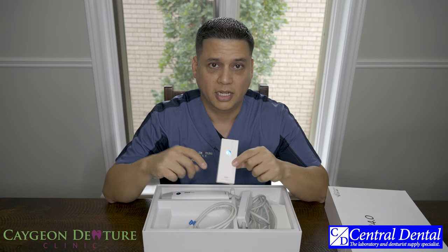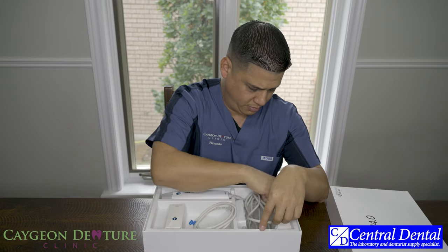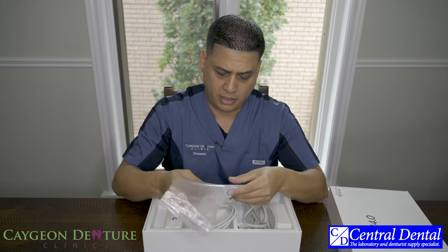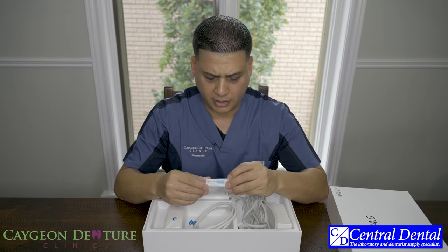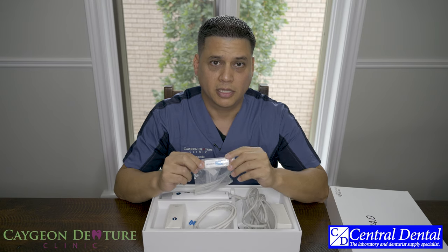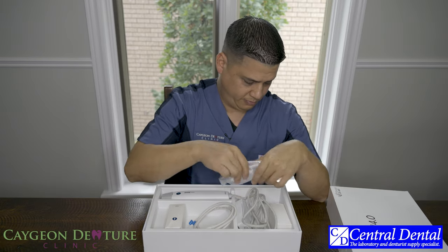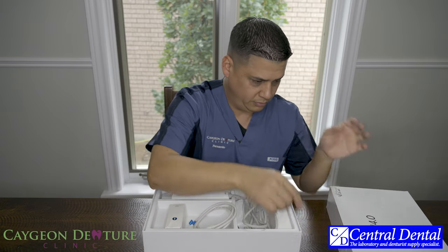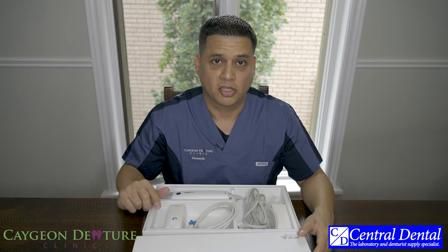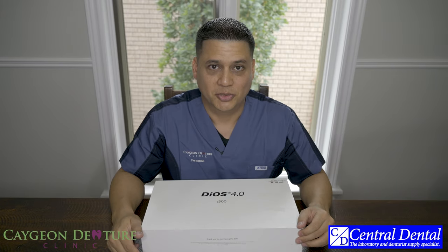There is a USB stick — I would guess with some information on the scanner itself. I haven't actually looked at it, so I'm not sure what's really inside. That's pretty much the main contents of the main box. Let's have a look at the accessories box.